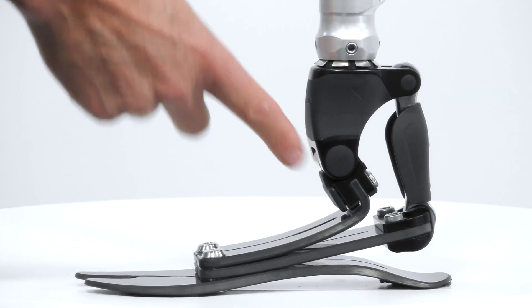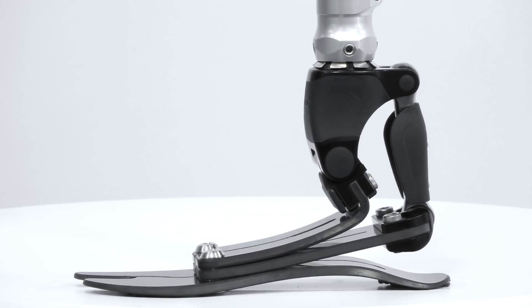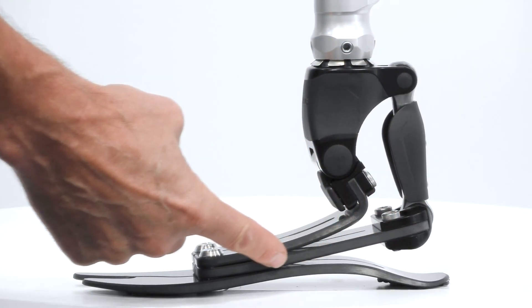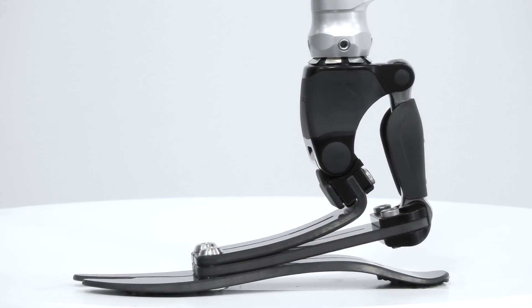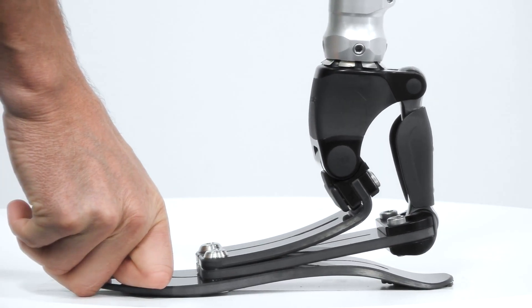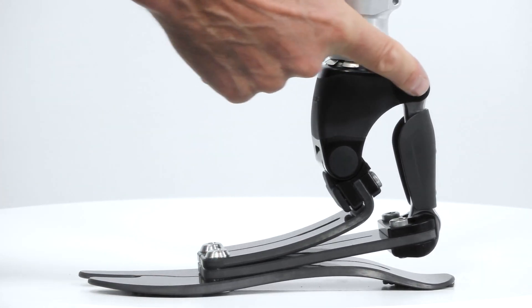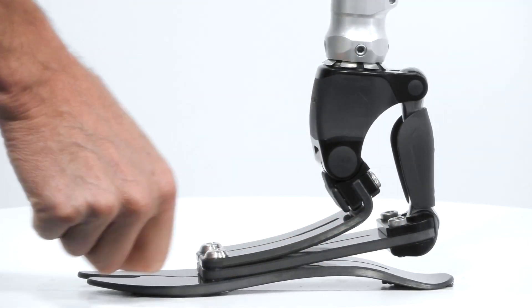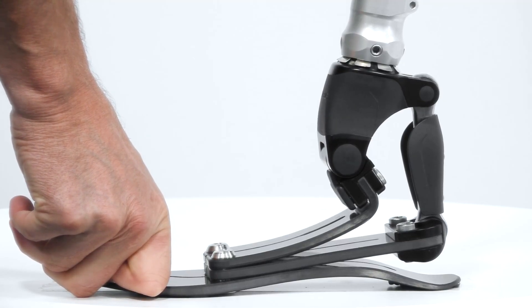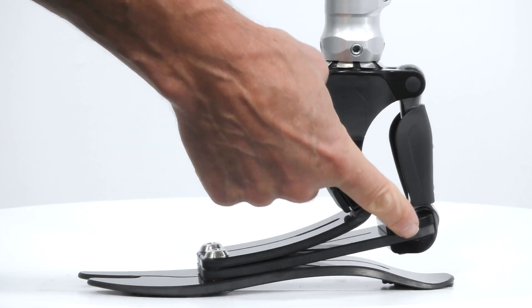Here we can see the pivot, or the point of rotation, and if we simulate dorsiflexion and plantar flexion, you can see how this housing connects with this proximal and distal link to the middle blade, and how the middle blade deforms during both dorsiflexion and plantar flexion. If we simulate initial contact or early stance phase, you can see that as we rotate the pylon posteriorly, this pushes the link downwards, deforming the middle blade — and this is what gives us our controlled plantar flexion response during initial contact.